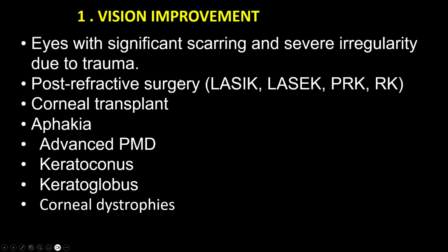Now, in eyes with significant scarring, severe irregularities of the cornea due to trauma, or after cornea scarring due to maybe a resolved infection that leaves the cornea scarred, or post-refractive surgery, or even degenerative or primary scarring of the cornea, or degenerative conditions that can leave the cornea thinner and bulging, it is best to recommend the scleral contact lens.